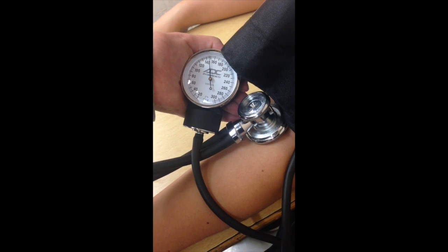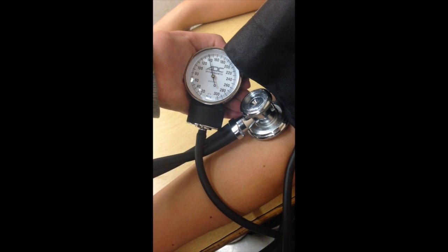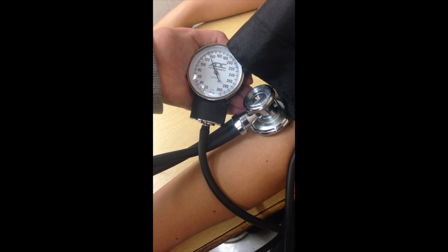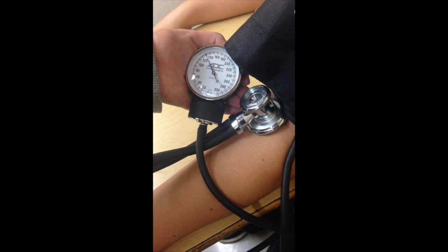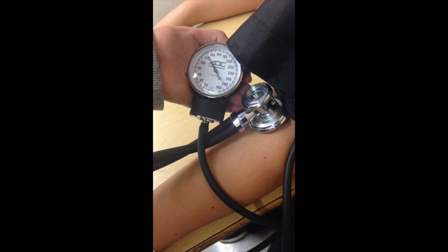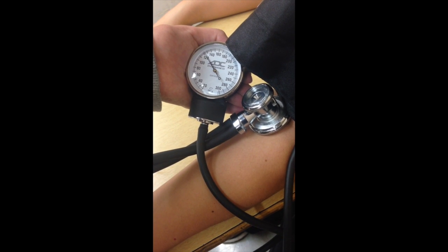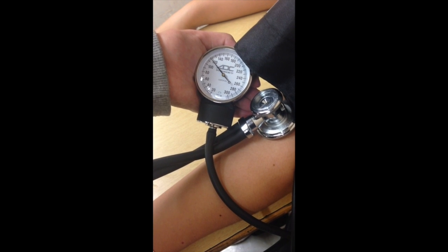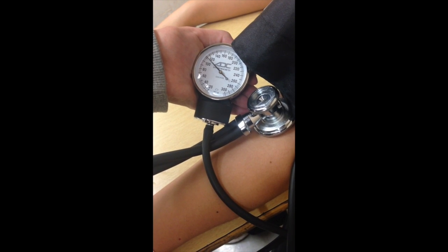The first sound that you hear will be your systolic blood pressure. As you continue to listen, the last sound that you hear will be your diastolic pressure. The sound that you will be hearing will be similar to that of a heartbeat.